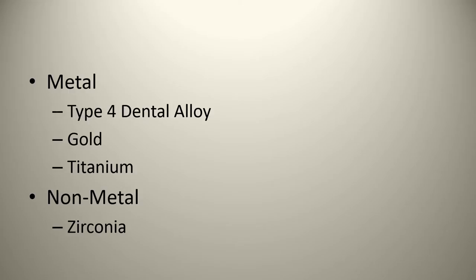I'm not quite sure from a long-term perspective what the long-term studies on these materials demonstrate. You know, cycles of loading, unloading, cycles of heating, cooling, cycles of being in the mouth, bathed in saliva with different types of ions around them. So with other materials, galvanic cell reactions and things that can occur, the list goes on. So I'm not really quite sure what the studies would basically indicate as being the best material, whether it be metal or non-metal.